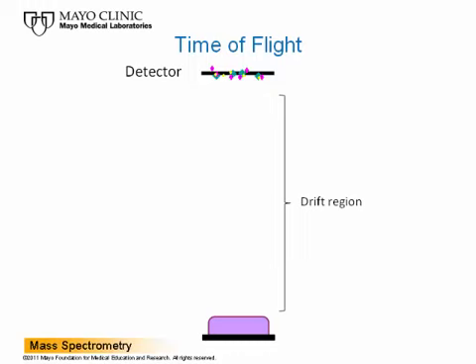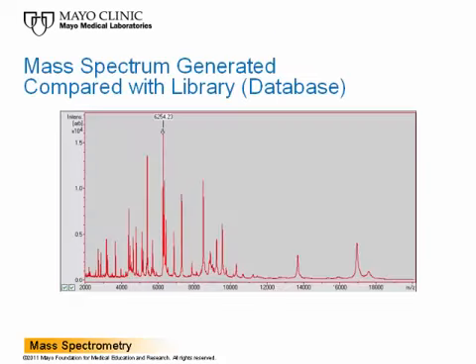Only highly abundant proteins that are of low mass and ionize readily are detected. These are typically ribosomal proteins, although the specific nature of the analyzed proteins is not part of the analysis. The mass profile is used as a fingerprint or mass spectrum, as shown here, to compare with those of well-characterized organisms in a database. The spectrum typically includes genus and species-specific peaks, so that with a comprehensive library of spectra, the genus and often the species of the organism may be determined using bioinformatics.